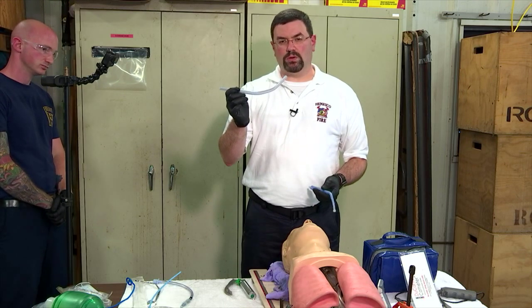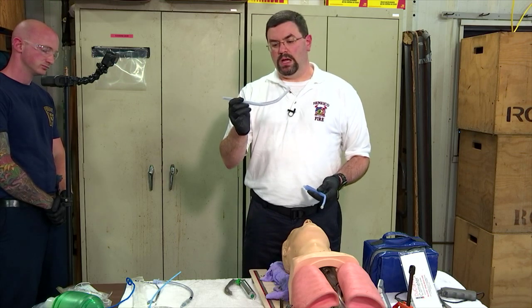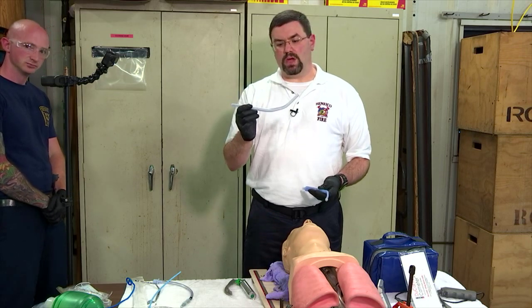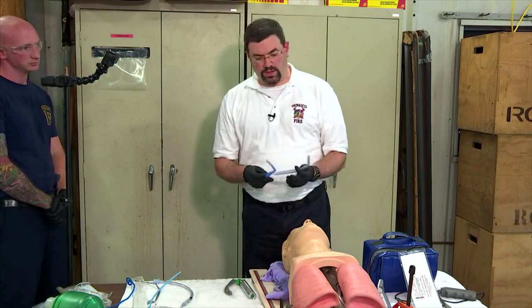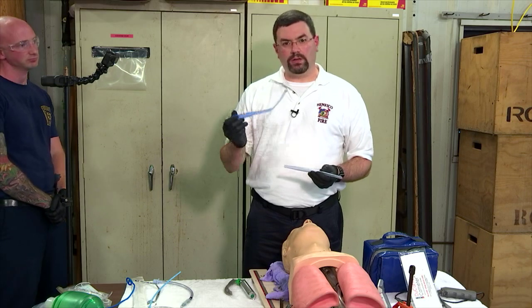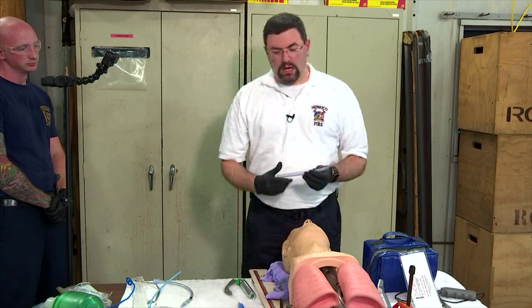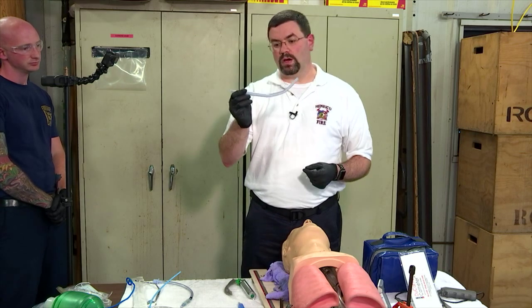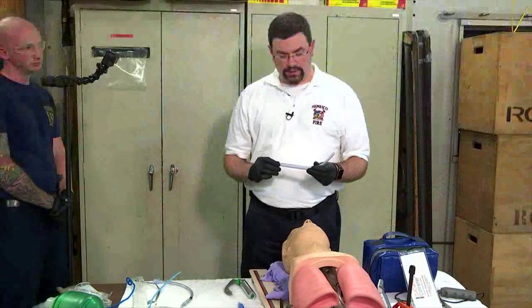These catheters should be rolling out very soon. They're in the process of ordering them and getting them into the ambulances. At least for the short course, hopefully these will be in all of your airway packs, maybe replacing the Yankauer altogether. If you look online, they talk about what these should be used for. If you have somebody that's drooling a little, these will still work. They'll work at your dentist office, but for contaminated airways and sucking up Denny-Moore beef stew or something very similar, this DuCanto device should certainly be a little bit better.